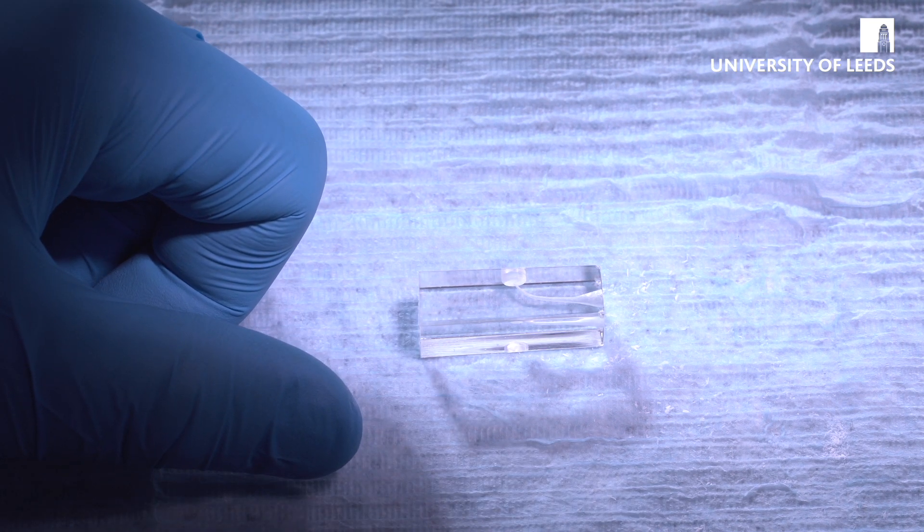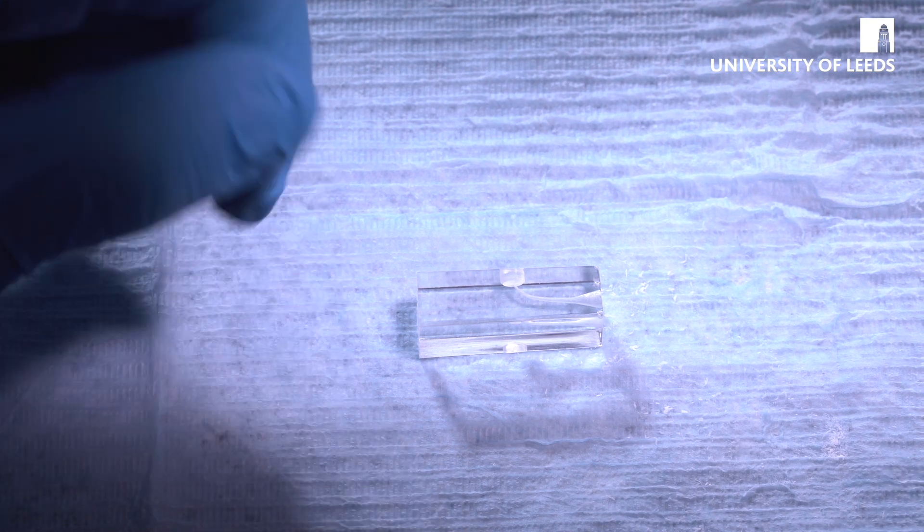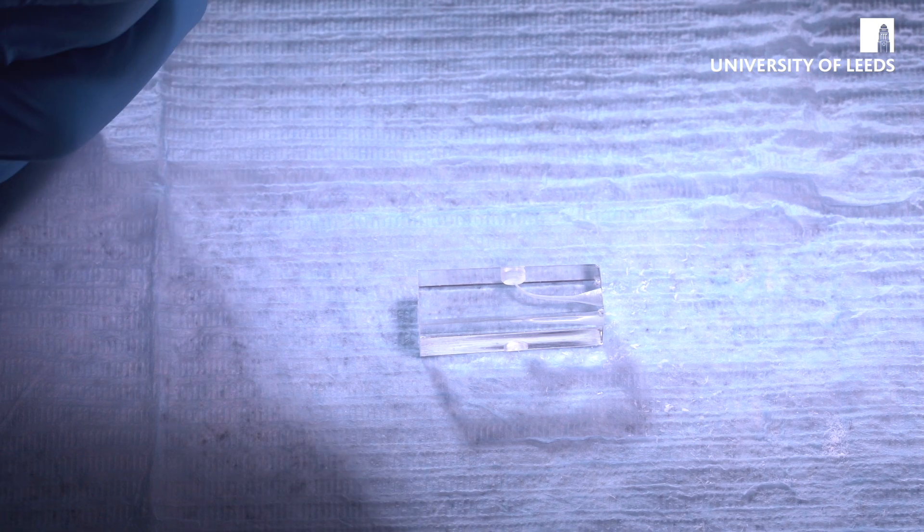So this is a revision demonstration — you already use lateral compaction as part of the CSB skills course — but we're just going to go through it again and how it may differ when you are using rotary instrumentation and particularly using wider canals.